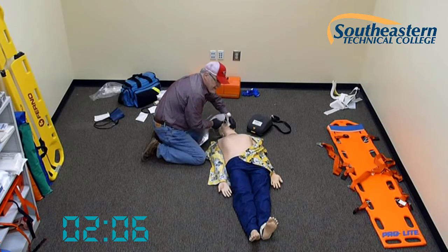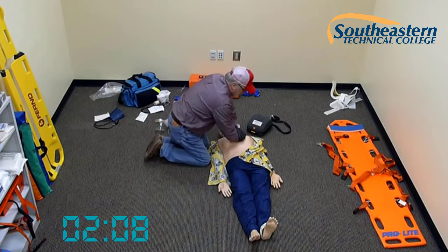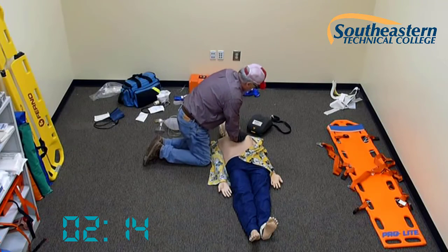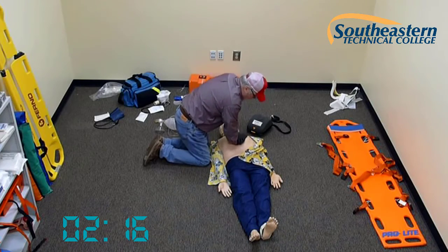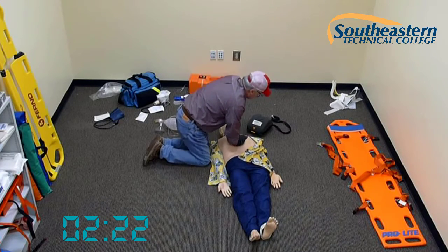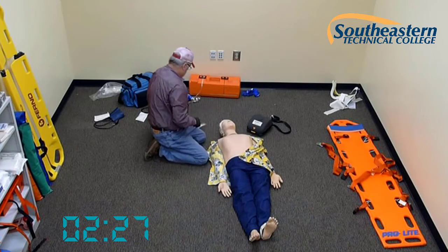Beginning my 5th set of compressions, I see my partner coming with an AED. Continue. 1, 2, 3, 4, 5, 6, 7, 8, 9, 10, 11, 12, 13, 14, 15, 16, 17, 18, 19, 20, 21, 22, 23, 24, 25, 26, 27, 28, 29, 30. AED is now on the scene.